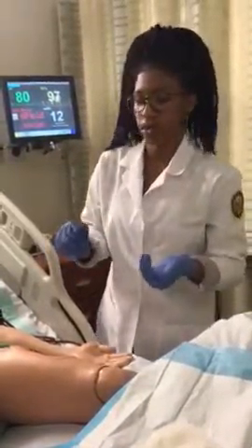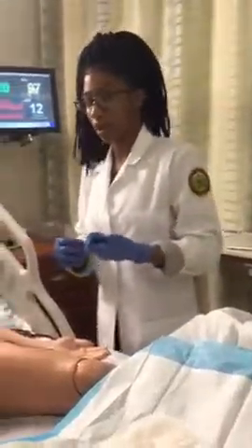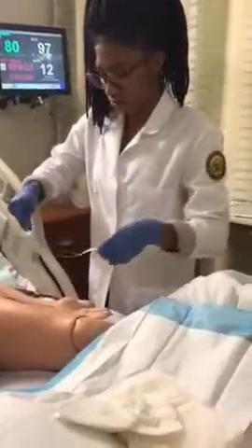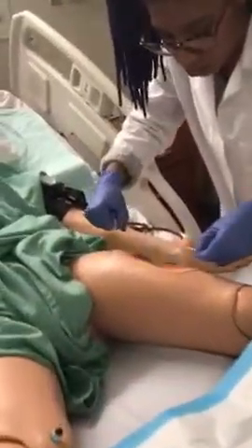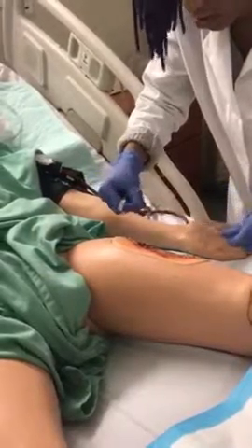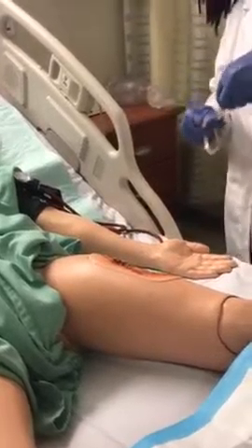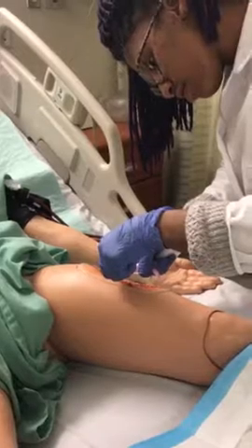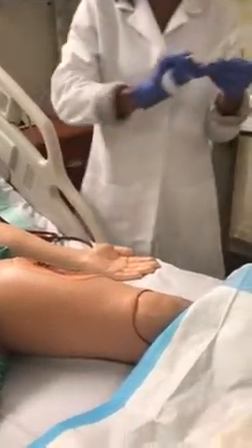And I'm now going to measure the wound. I'm going to do so without touching the wound. The wound was previously measured in inches, so I am doing the same. It is 5 inches long and 1.5 inches wide. I'm now going to grab a clean swab.